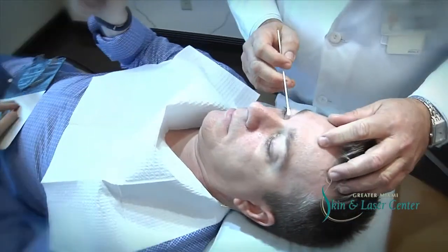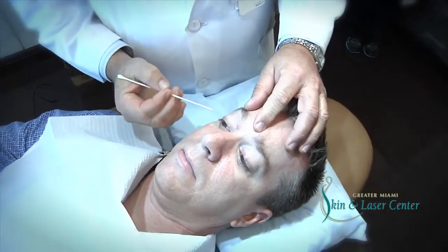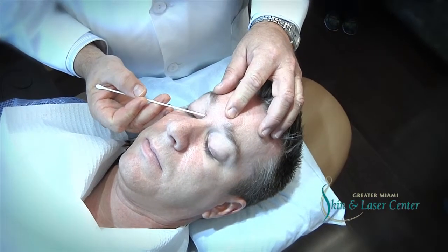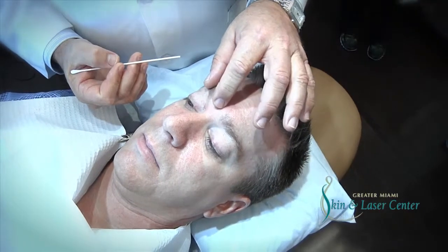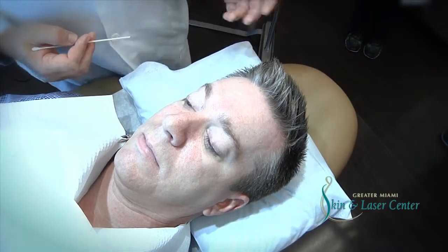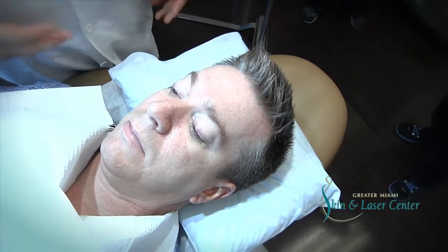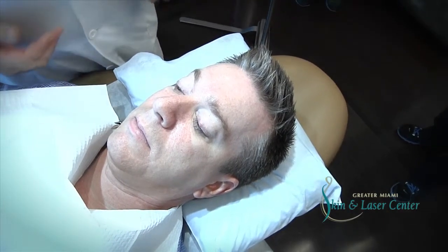This little spot right here has been identified as a basal cell carcinoma. The idea of what we're going to do today is anesthetize the whole area. We're going to cut around the smallest little piece of skin to preserve as much normal tissue, because in this area every little bit of tissue is going to make it better for the recovery. And once we cut it out, when I look under the microscope, if I see that the tissue is all clear, I'll go ahead and just put a few stitches in and sew it up. If we find that there's a little bit of positive tissue somewhere, we can come back and just take another little sliver.